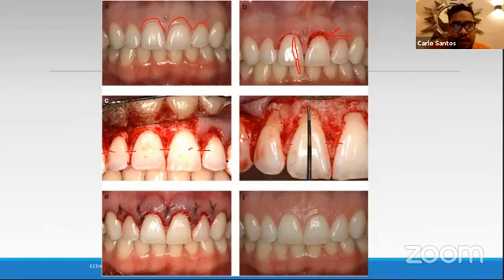But this is important: you don't include the papilla part. Why? Every time you make an incision, as a sulcular incision or an envelope flap, every time you suture it back, this recedes around 0.5 to 1 millimeter. So, given that this is an aesthetic zone, you will produce black triangles if you include this. So don't include that. You just make a straight incision here and then raise the flap. Okay, so given that you understood that, let's go back to our aesthetic crown lengthening procedure. Now, using your perio probe, measure 2 millimeters from the cemento-enamel junction.